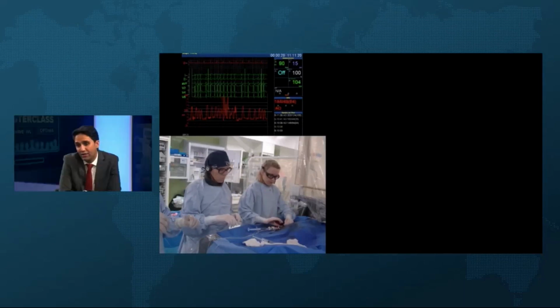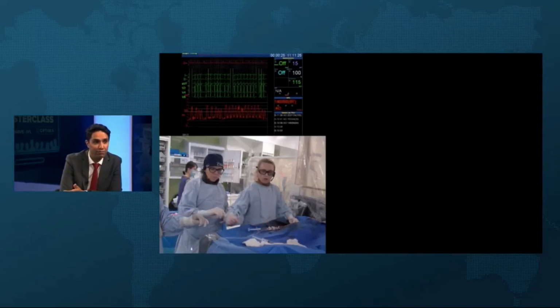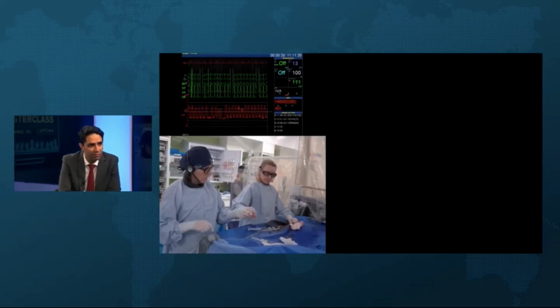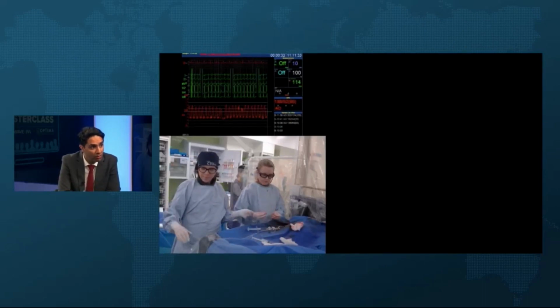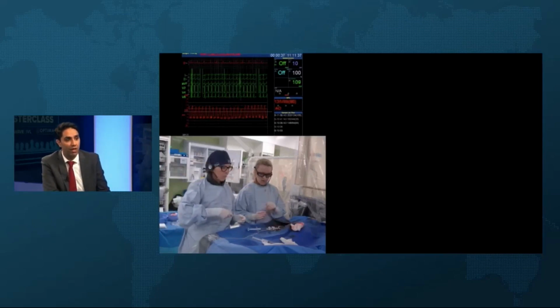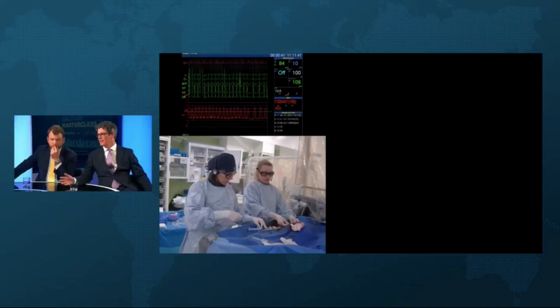And so I actually use the 3-connector cell stents in nodules just because I think I have an extra bit of metal that might help prevent it. Well, that's the hypothesis. But that's the mechanism of failure, right? We know that in eruptive calcification, the mechanism of failure is reprotrusion through the struts, if we can see that.